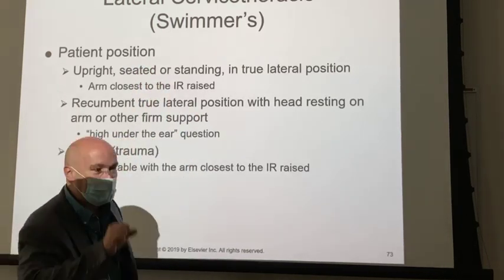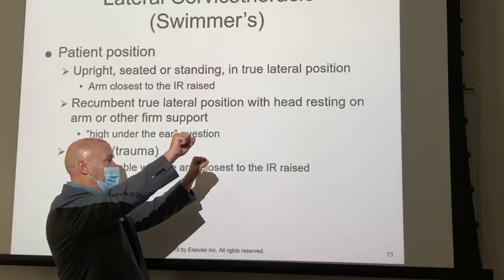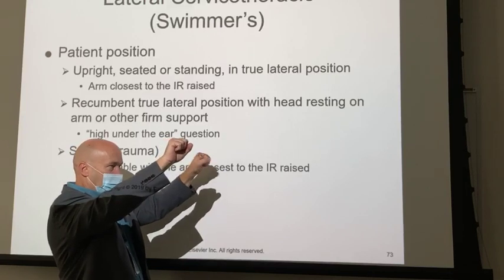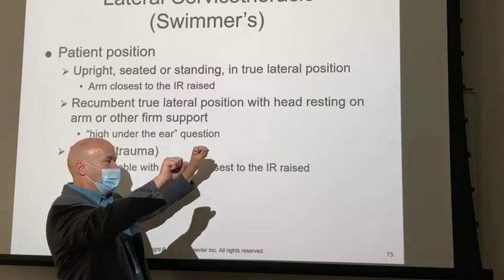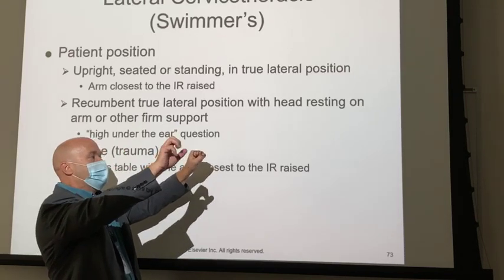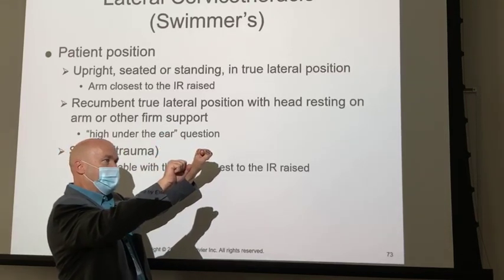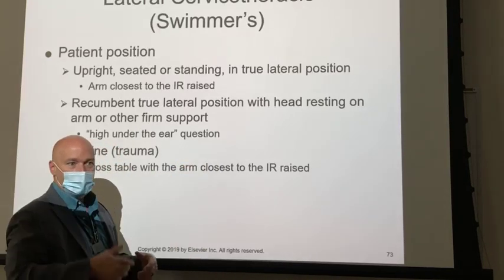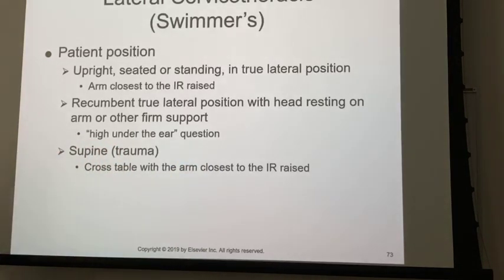And what that does is it takes that downside shoulder, okay? So you've got an upside shoulder and a downside shoulder. Takes the downside shoulder and projects it even lower. So between those three things, between pulling this shoulder down, angling this, and obliquing just a little bit, you might be able to see the anterior alignment.